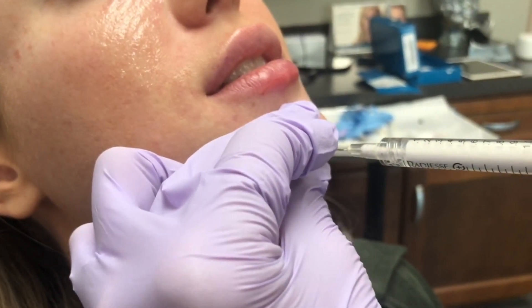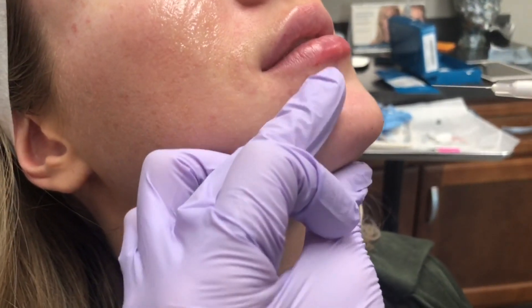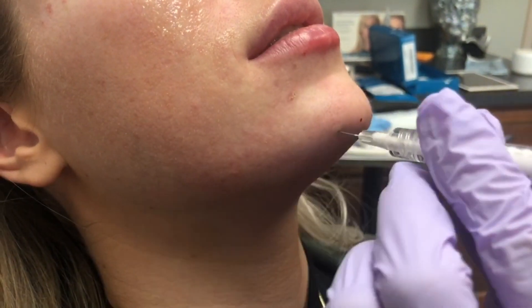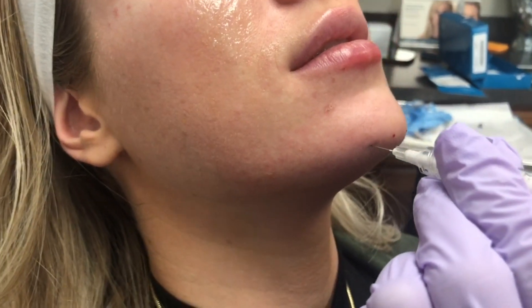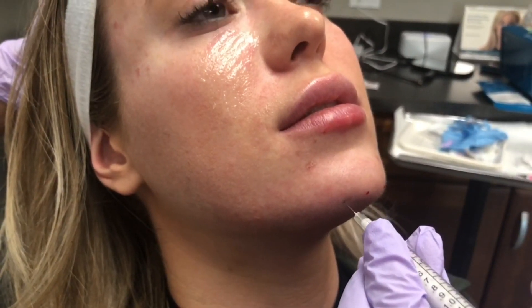This filler does two things: it's going to rejuvenate the skin and also fill. It's a wonderful filler for creating contour and shape. This is a great product to use on the chin, the jawline, and the cheeks, because you lay it deep on bone and the elasticity and support it provides is really going to give you exactly what you need when you're looking to create that very chiseled and defined jawline.